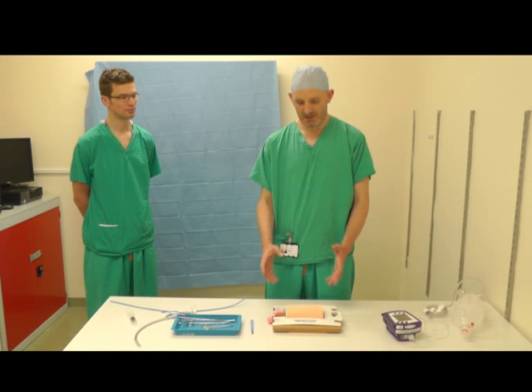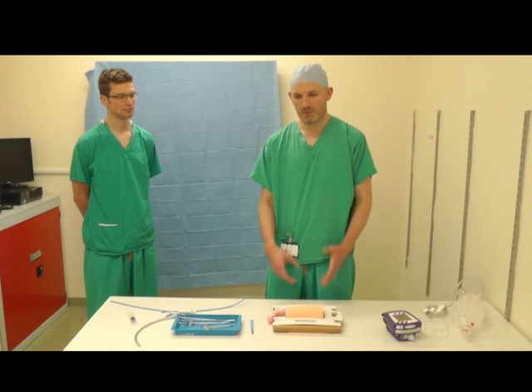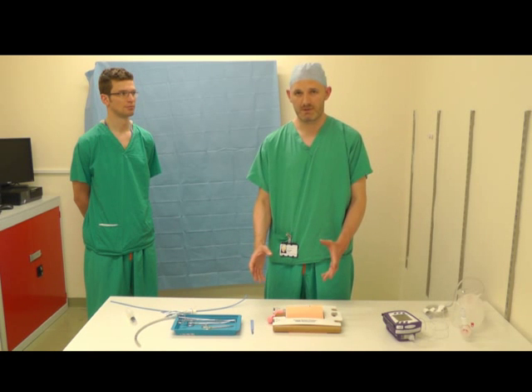And it's unlikely you'll have these available in an emergency situation. First of all is do a silent run through of the procedure, and then we'll go through it bit by bit, breaking up into small steps.